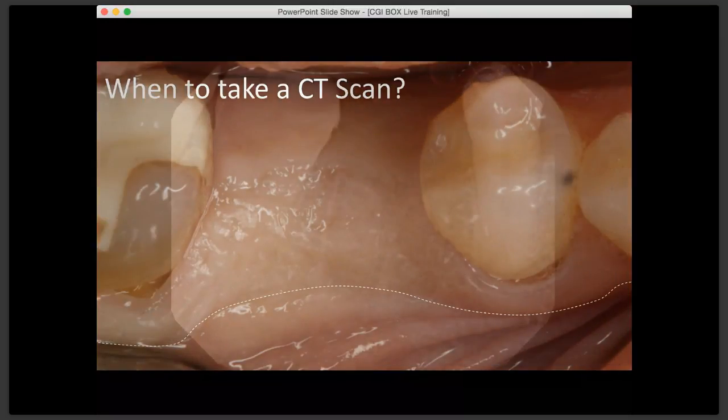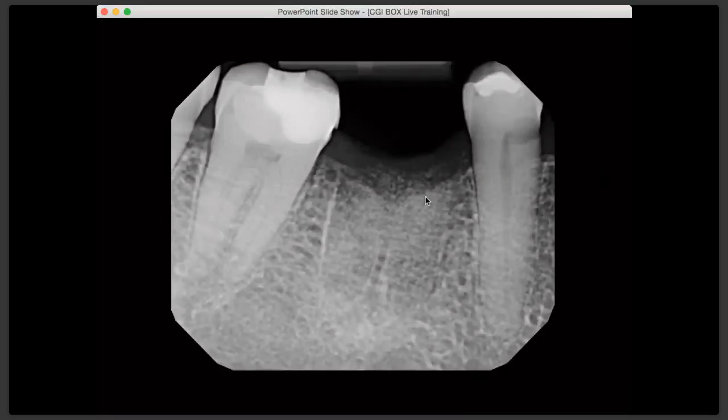Okay. Take a look at maybe some particles that are not at the coronal part of the socket. Okay, look at the interseptal bone. It's still there. It's healing nice, but you know what?